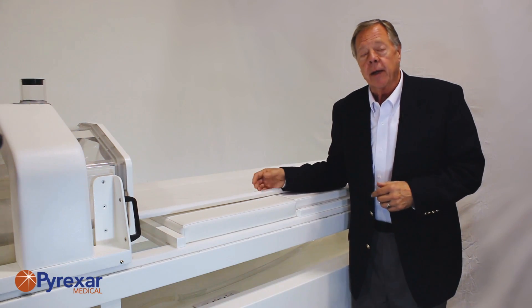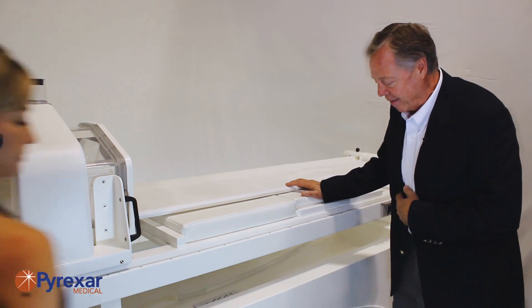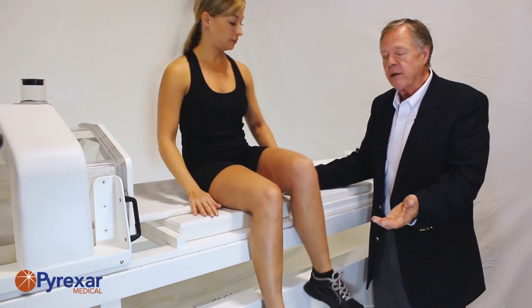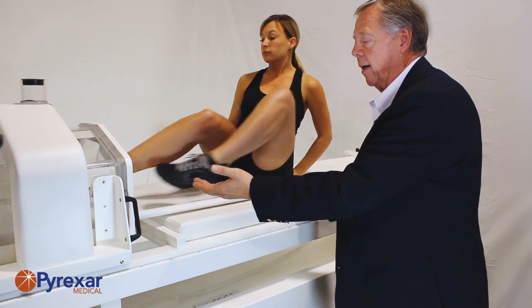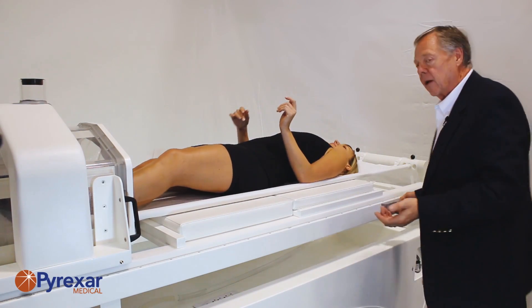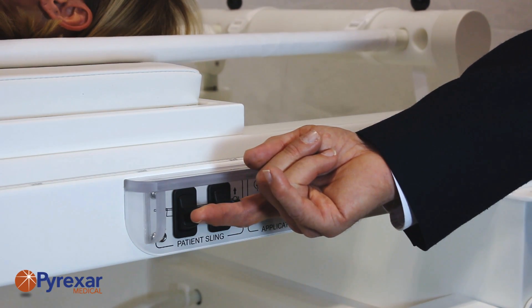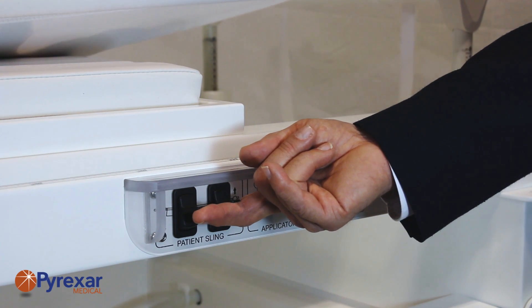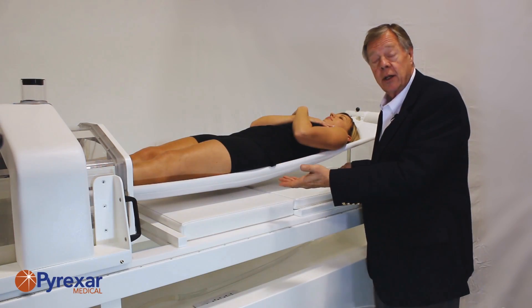We'll demonstrate how this is used in treating a patient. The patient will sit on the sling, simply rotate their body and insert the legs inside, then lay down. We then elevate the sling to support the patient in a stretcher-type arrangement, because we need to slide the phased array device over their body and completely surround their body with an array of antennas.